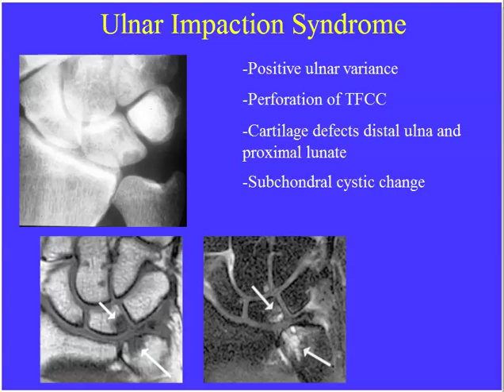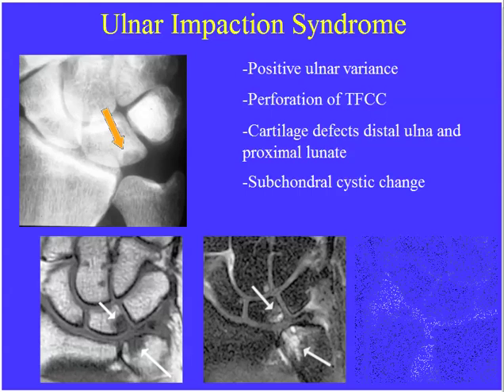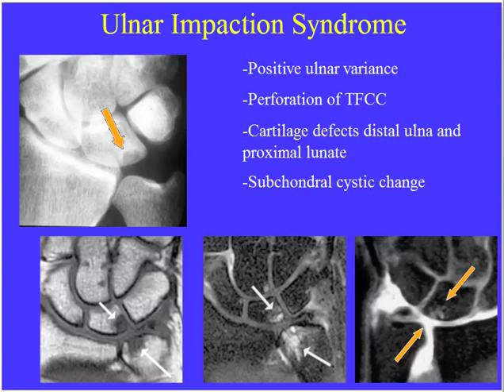Ulnar impaction syndrome is associated with positive ulnar variance. It results in perforation of the triangular fibrocartilage, impaction of the distal ulna against the lunate, causing ulnar-sided pain. Eventually the articular cartilage tears, leading to arthrosis and osteoarthritis with subchondral cyst formation and marrow edema. A perforation of the triangular fibrocartilage extends from the distal radius to the distal ulna. In this case: mild positive ulnar variance, marrow edema within the adjacent lunate representing impaction, and a full thickness tear of the central triangular fibrocartilage.